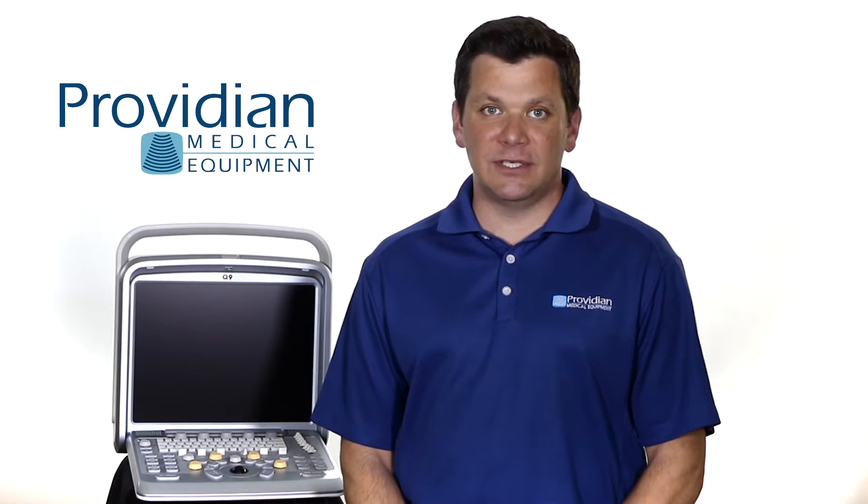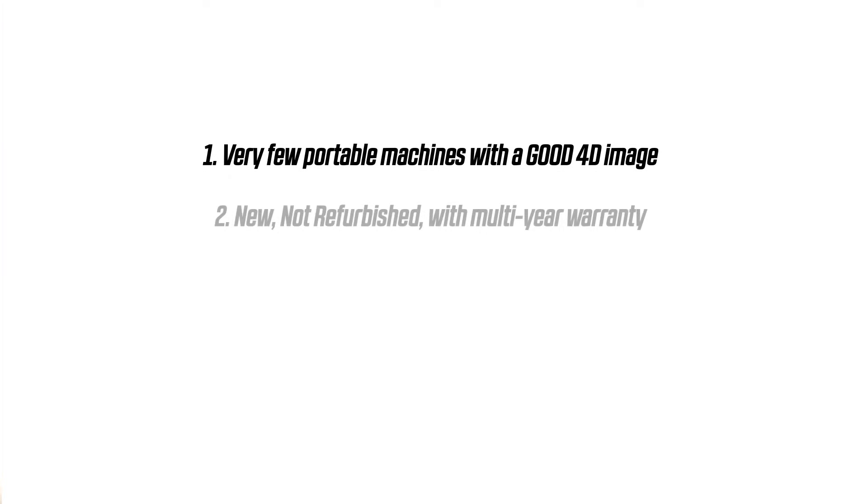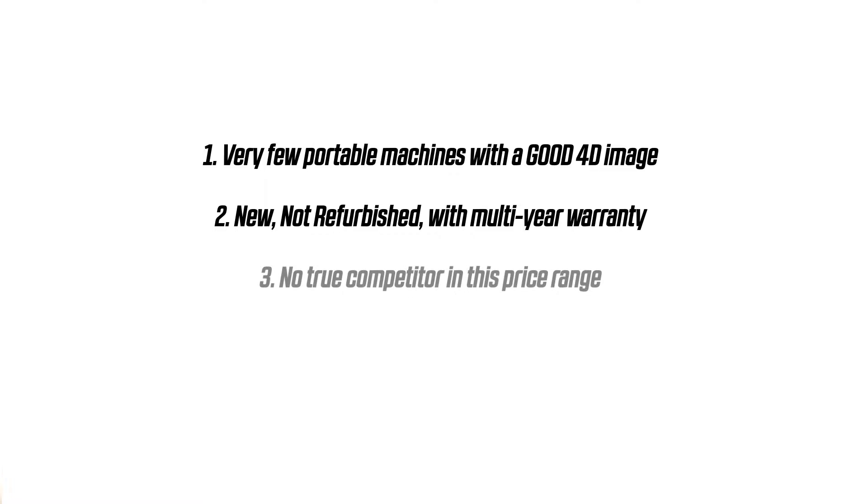I think most will find that it does a really good job and it is the best alternative out there in this price range. The people who purchased this for its 4D capabilities did so for these reasons: one, it's one of a few portable ultrasound machines that can actually provide a good 4D image; second, the Q9 is offered new, not refurbished, and has a multi-year warranty; three, there is nothing in this price range that has quality 4D capabilities.